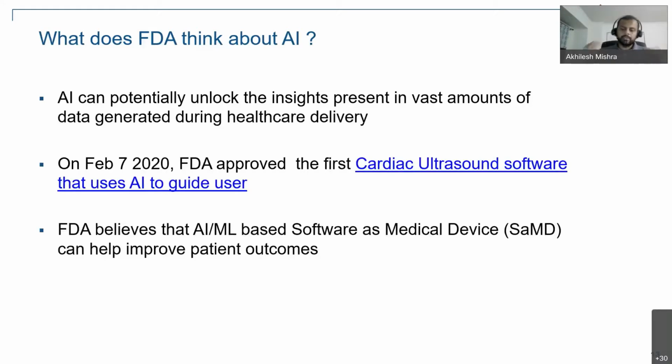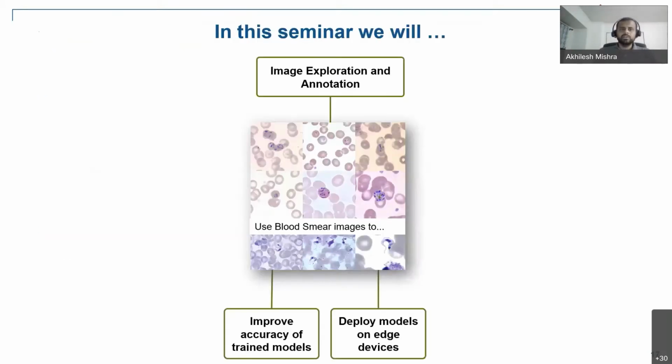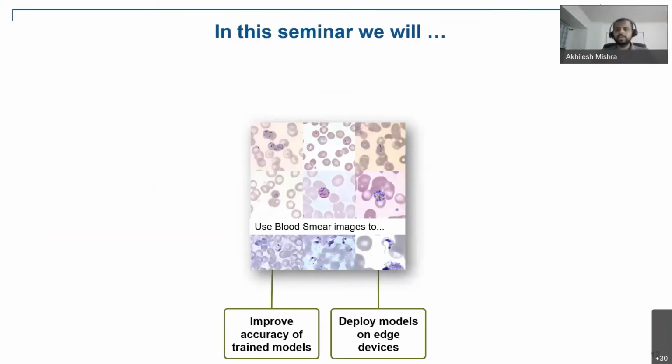So we at MathWorks are very well aligned with FDA, and anything which we do in AI, machine learning or deep learning, we have the tools. Again, I would emphasize, although it's not covered in today's talk, we have those capabilities which let you get those algorithms verified and validated. So, all right, enough of the introduction part.